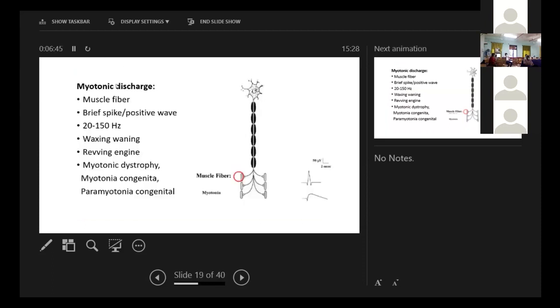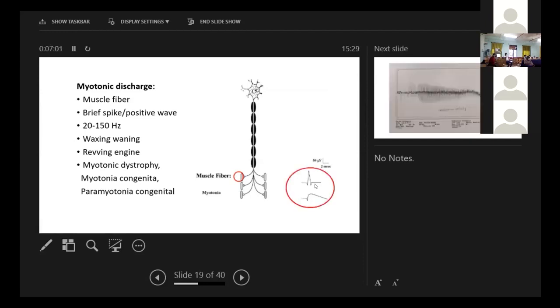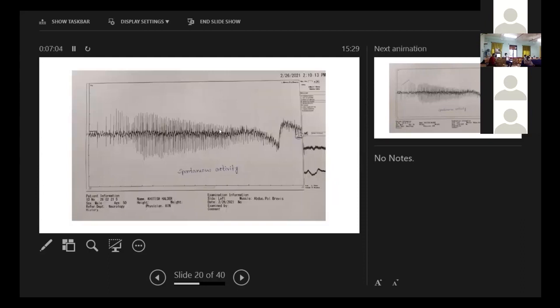This is a myotonic discharge, which again comes from muscle fiber. There's a waxing waning characteristic to that. If we listen, the sound will be like revving engine. And seen in myotonic dystrophy, myotonia congenita. So these are the characteristics. And if you see the tracing, this is the waxing waning pattern.